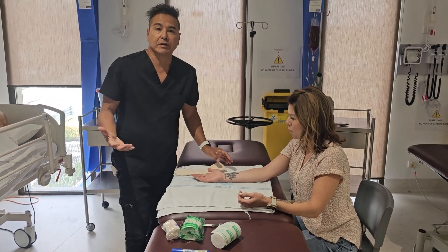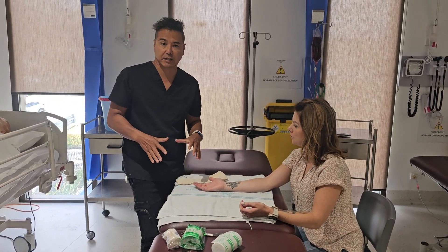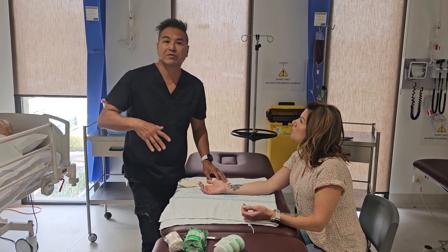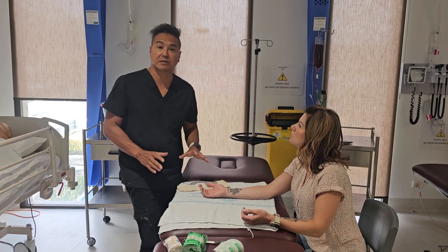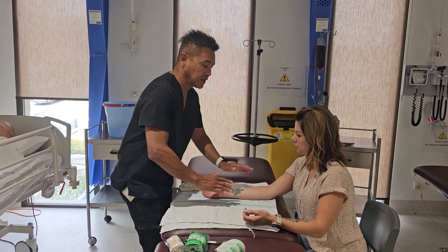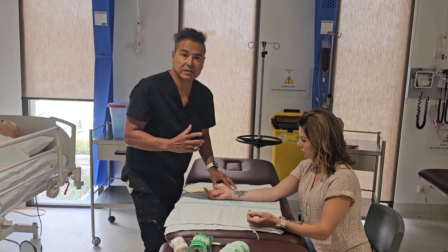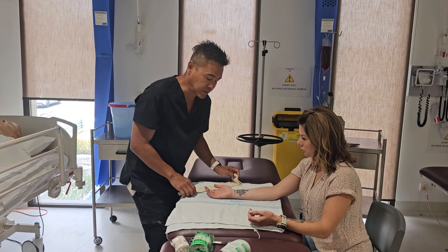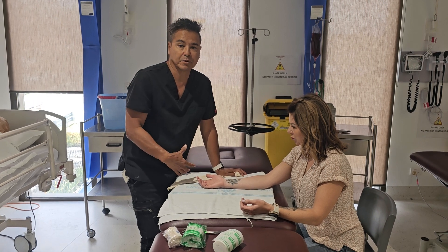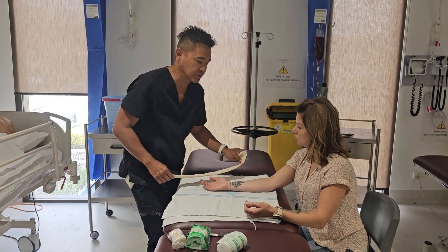I'm going to be doing a plaster in the context of how I was taught in a fracture clinic. In a fracture clinic it's not acute — we've got time, and we're assuming the plaster is going to stay on for quite a long time. What we usually do is apply moisturizer to the limb to look after the skin, since it's going to be non-visible for up to several weeks.